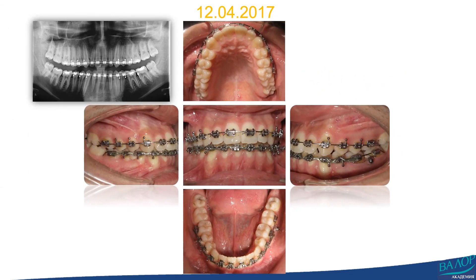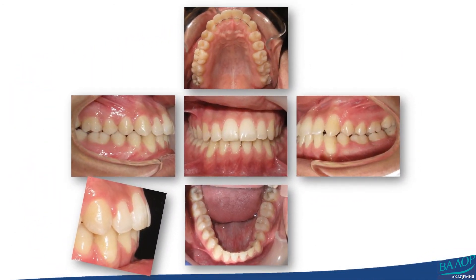Until April 2017, a 17×25 stainless steel arch wire had been in place for nearly two months. This was the moment for final evaluation of the achieved goals and necessary corrections — in all my treatments we require an OPG, photos, and dental casts. It appeared that wire bends were required to upright the maxillary right lateral incisor and mandibular left premolar. I had to remove the mini-screw at this final stage, as it had served its purpose. After three more months, the braces were debonded, with a total treatment duration of 1.5 years. The overall achievement was a Class 1 canine-premolar relationship on the right side and Class 2 canine-premolar relationship on the left side, attaining overcorrection of the lower midline to prepare for possible relapse thereafter.